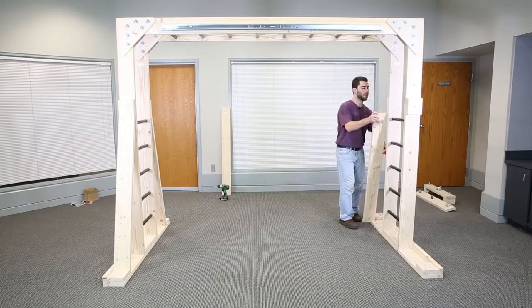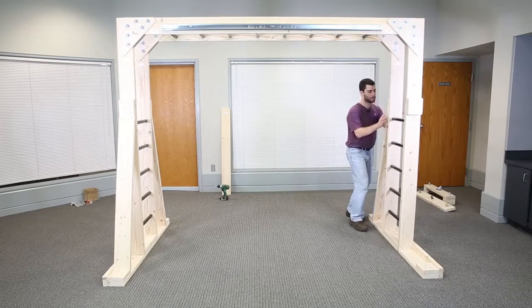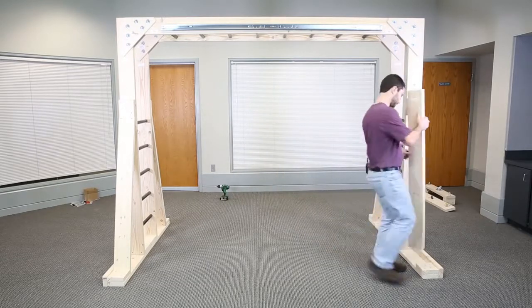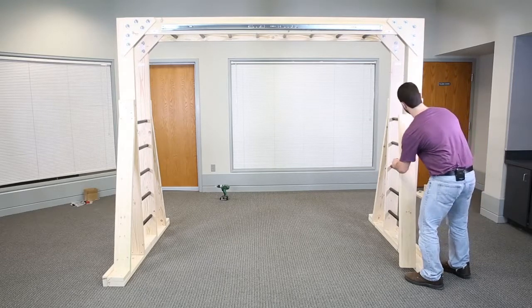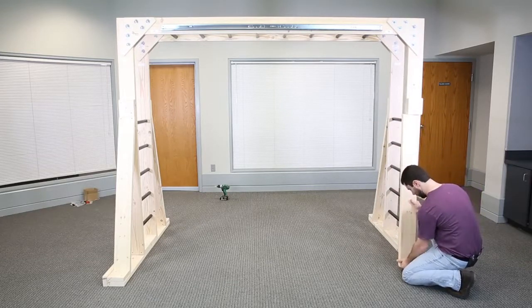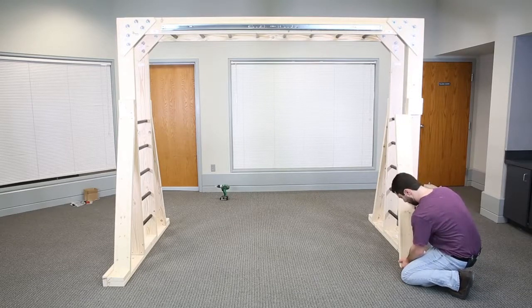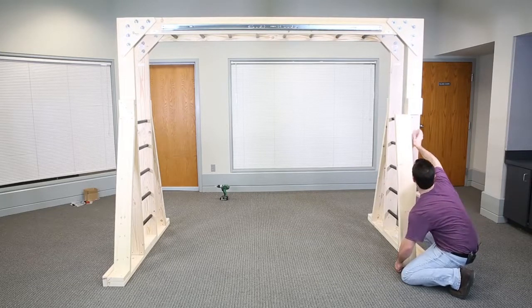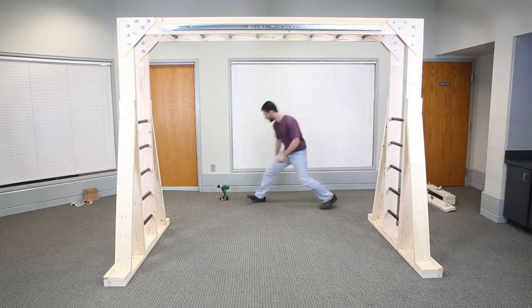Kicker brace A and KA line up. Kicker brace B and KB line up. Once they're in place, attach the screws.